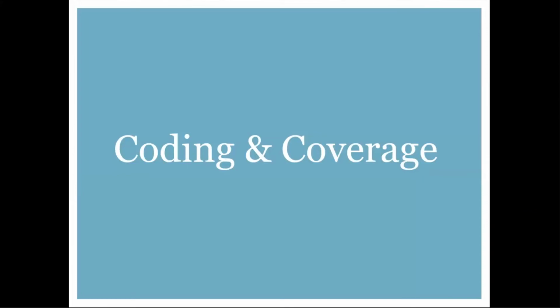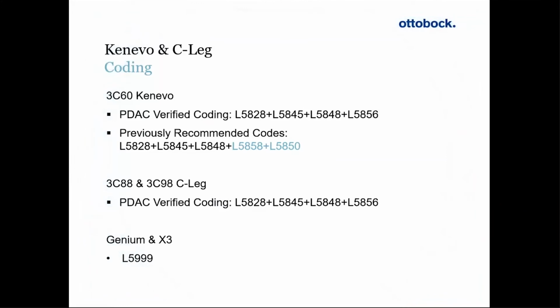So looking at the coding, I know Dr. Kannenberg covered it, but I just wanted to show you all four of our microprocessor knee joints that have coding: the new Kenevo coding, the C-leg, and the Genium X3, for which we still maintain the L5999 code. Next.